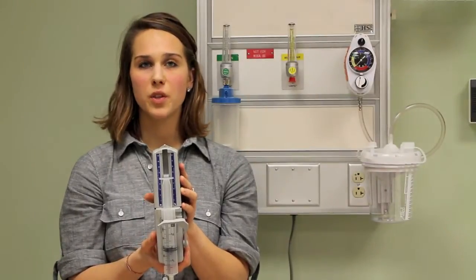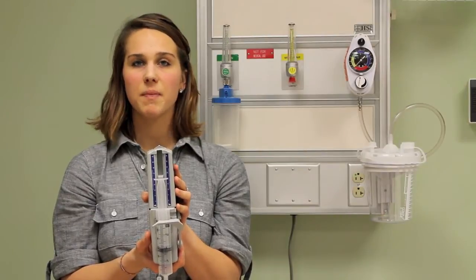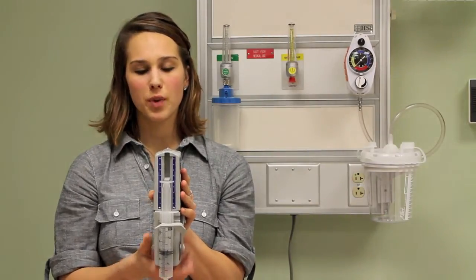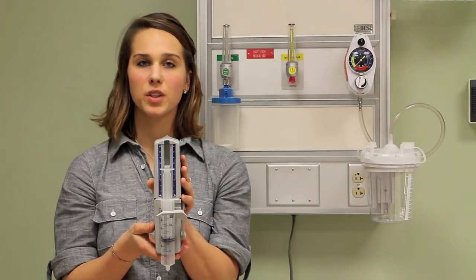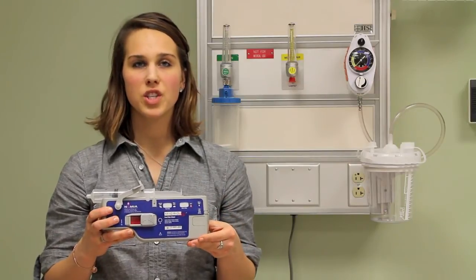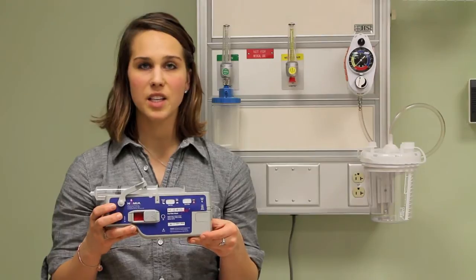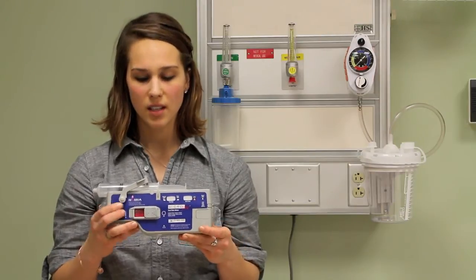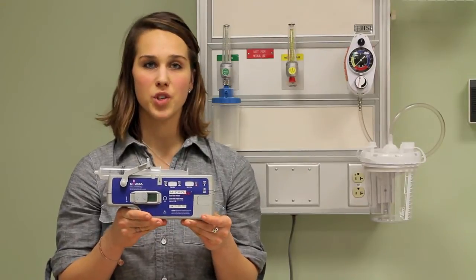The duration of an infusion is determined by the size of the syringe, how full it is, and the pump rate. The duration is indicated on the top panel of the pump. Consult your manual for detailed rate charts. Once the syringe is in place, the flow rate determined, and the administration set is properly attached to the patient, slide the on-off switch to the on position and you can begin the infusion.